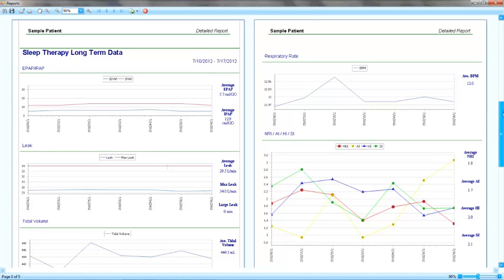2. Daily average leak figure. This will give you the daily average leak flows. 3. Tidal volume averages. Daily average tidal volume changes can be seen on this graphic. 4. Respiratory rate figures. Daily average respiratory rate for the selected timeframe.